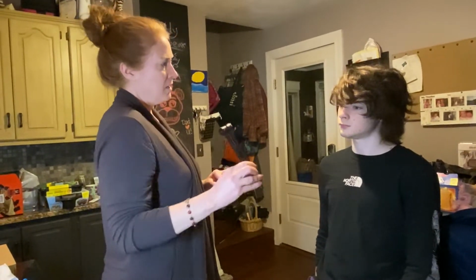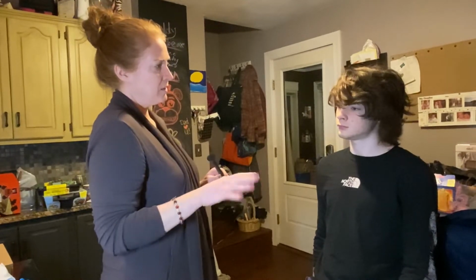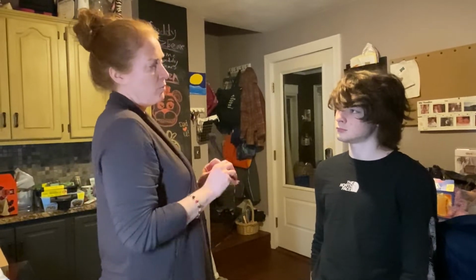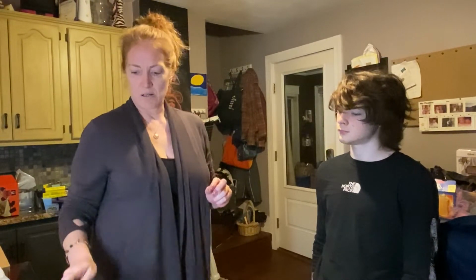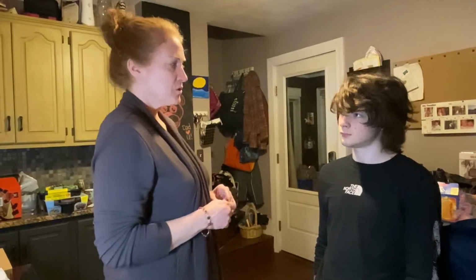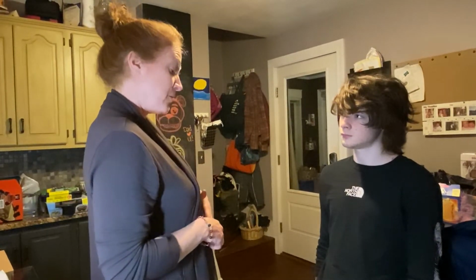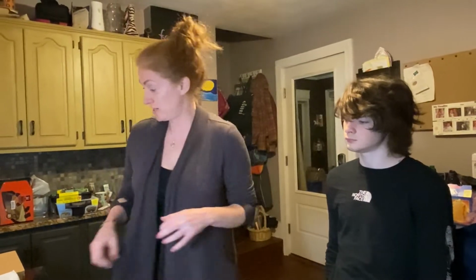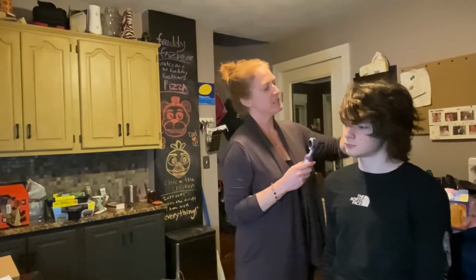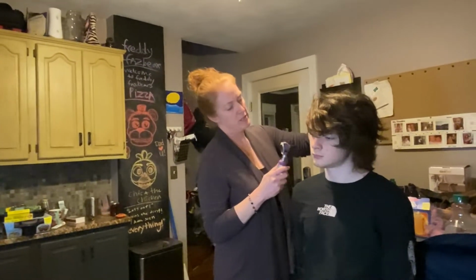Okay, based on that, I would say that your left ear has much better hearing. It had about a 2-to-1 difference in bone conduction and air conduction, where your right ear seemed to have a similar time for conduction. So now, if it's okay, I'm going to look inside your ear. So turn the light. I'm going to pull your ear up and backwards to straighten out your canal.